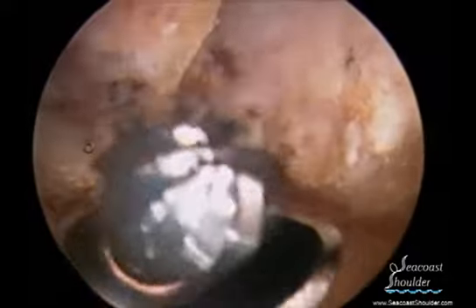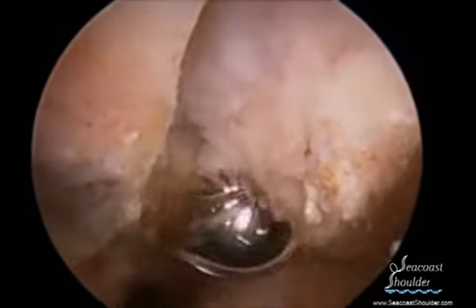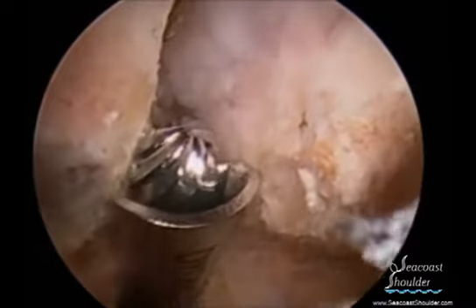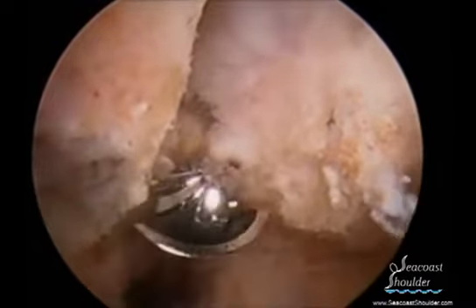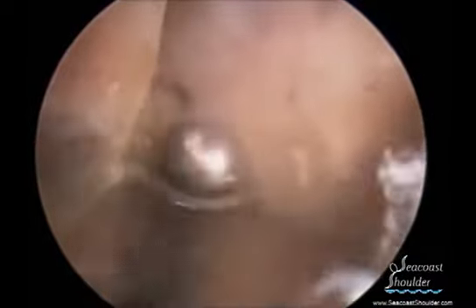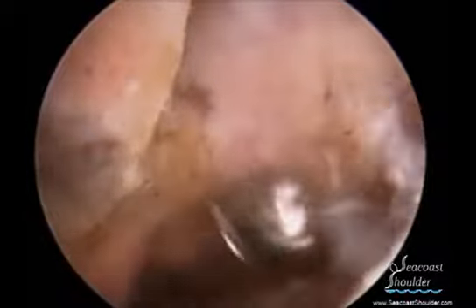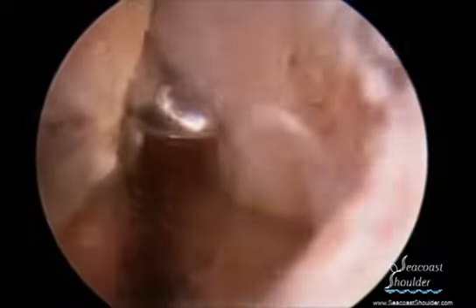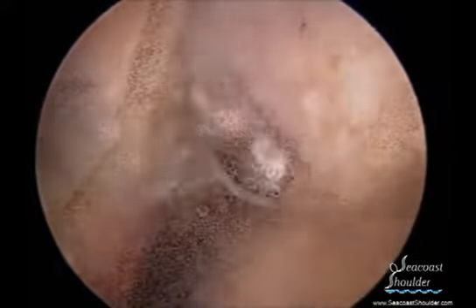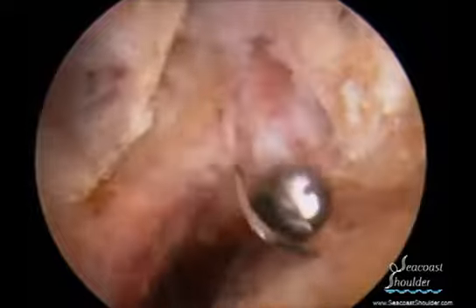This is a video of a patient with arthritis of the acromioclavicular joint on the left side. The video shows a shaver between the clavicle shown on the right and the acromion shown on the left. This joint is arthritic, and now in the beginning portion of the procedure, the shaver or burr is brought in and is designed to remove approximately 10 millimeters of bone from the end of the clavicle.